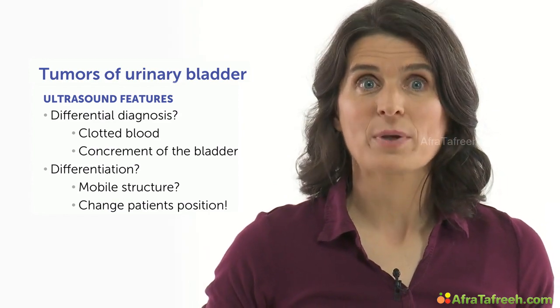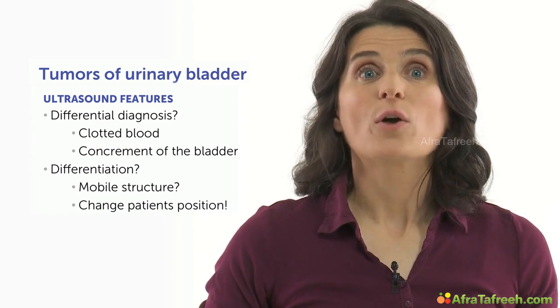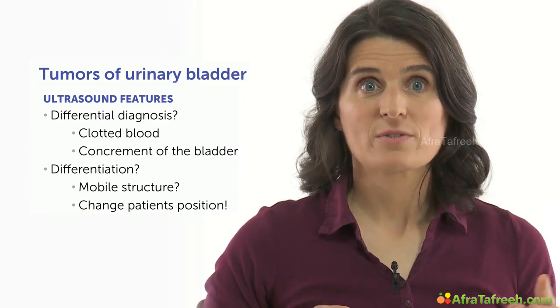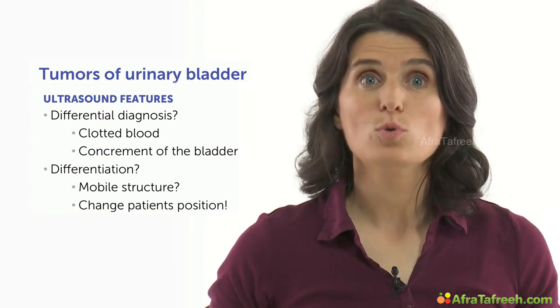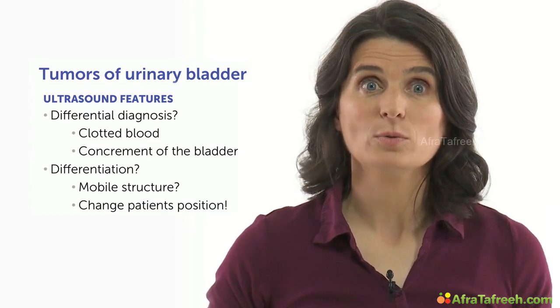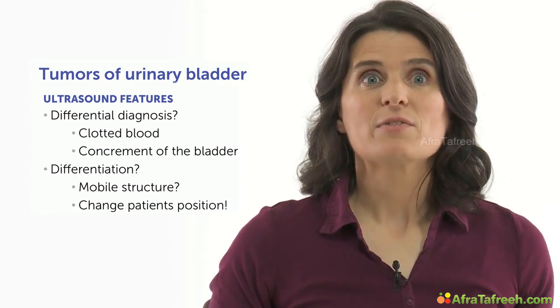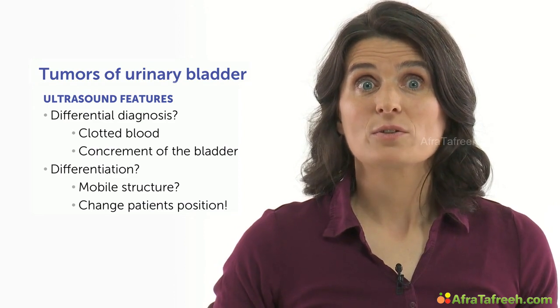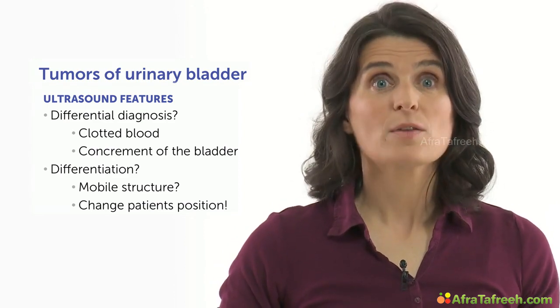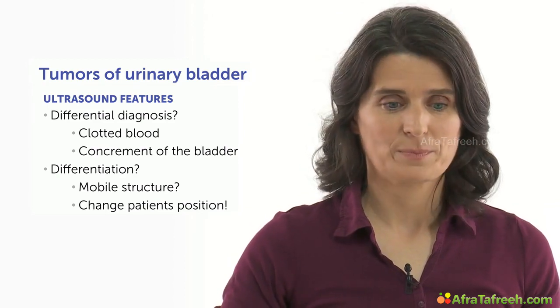We turn our patient to one side and keep our ultrasound beam on the object of interest. When the structure is staying at its place, it's most likely a tumor. When it is moving, clotted blood or a stone is more probable. In any case, even if it's not a tumor but bleeding or a urinary tract stone, the cause for this condition has to be found, of course, and the problem has to be solved, so the patient has to see the urologist.